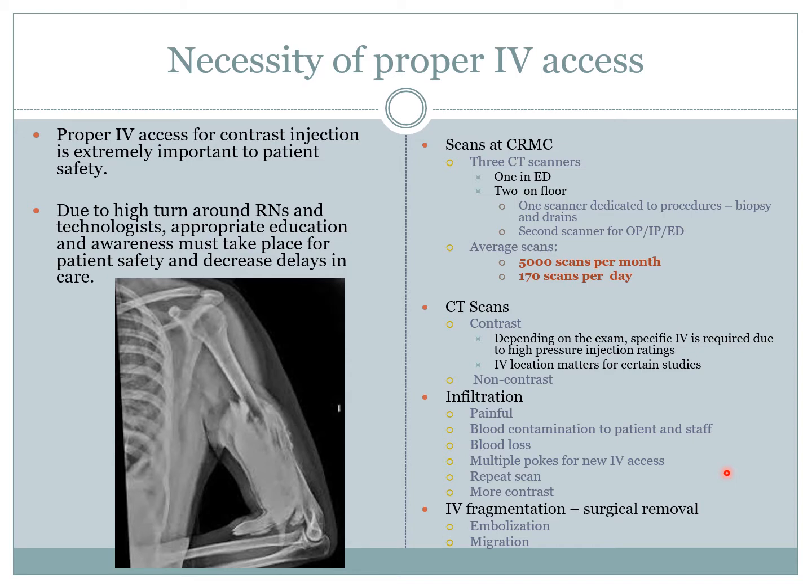And of course, if the scan is unsuccessful and we still need it, then unfortunately, once the new IV is placed, we have to get another study, and that means more contrast, more pokes, more radiation, and that's no fun for anybody. IV fragmentation is also a thing.